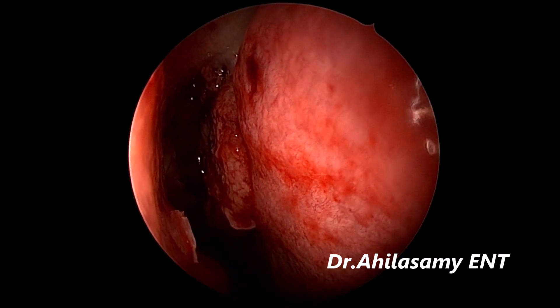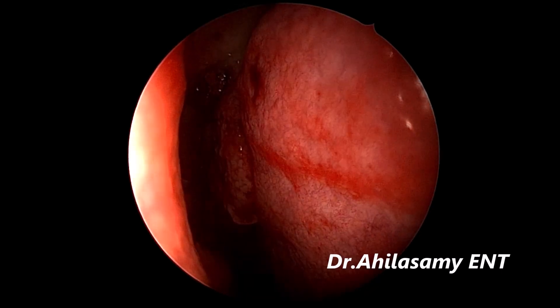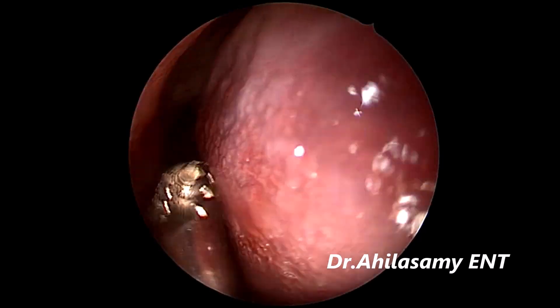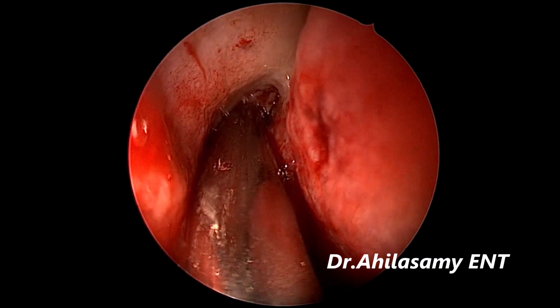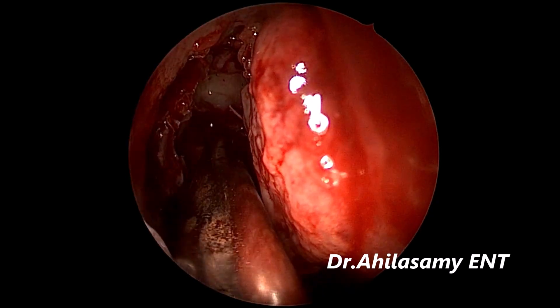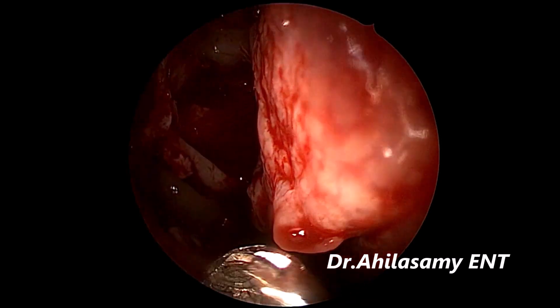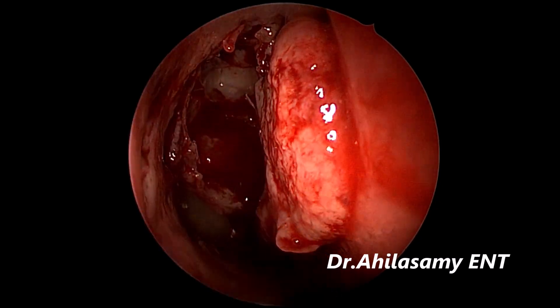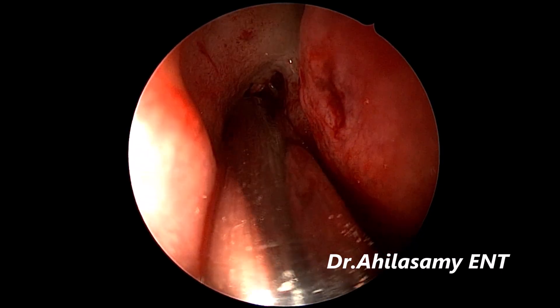And taking out the whole maximum part of the bulla. Rest of the remnants of the bulla will be shaved off with the shaver system. You can use the shaver for the entire step, but the bone chips may get stuck in the shaver blade — that's why I prefer this step. There is a little bit of remnant uncinate superiorly. This patient has no disease in frontal, posterior ethmoid and sphenoid, so we will not be unnecessarily opening those areas. A good antiethmoidectomy has been performed and the middle meatal antrostomy has been performed on both sides.